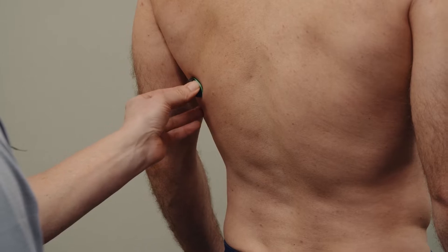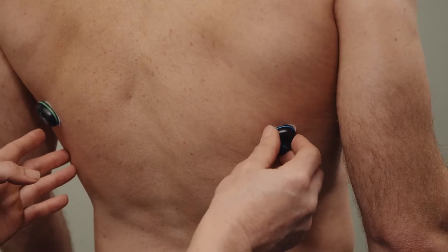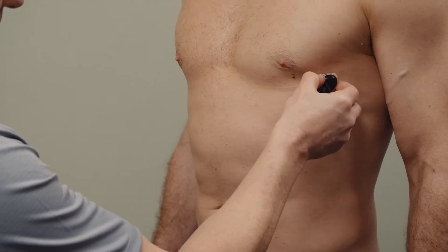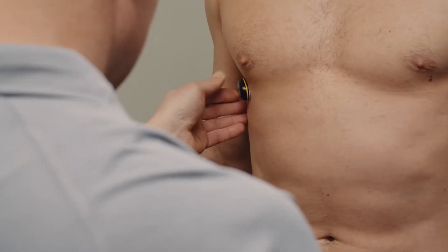Begin by placing Mr. EMG's sensors on your subject's latissimus dorsi muscles, left and right, and serratus anterior muscles, left and right. Follow our recommended muscle placement sites.